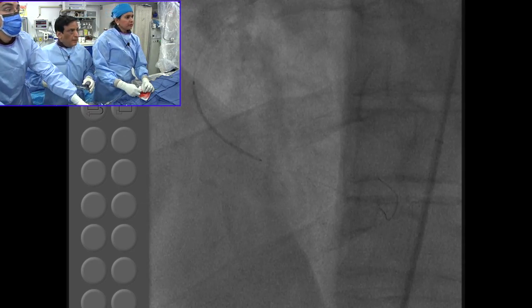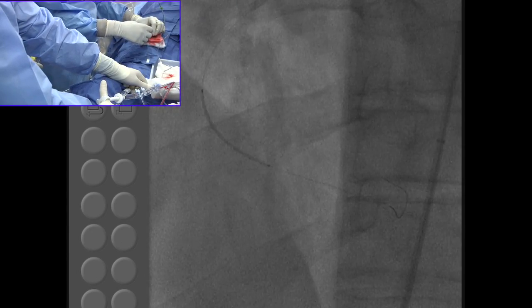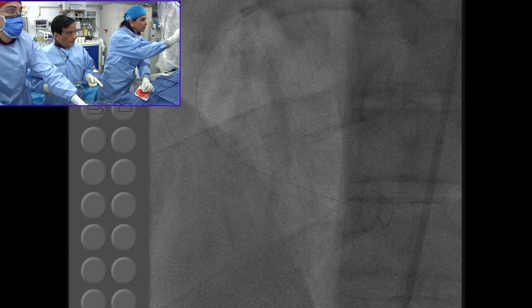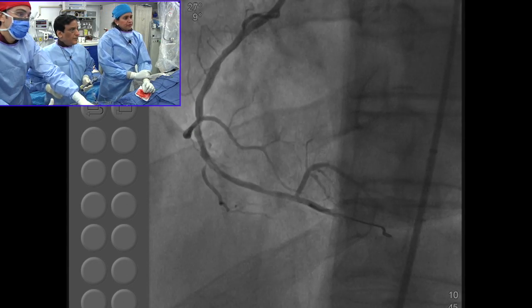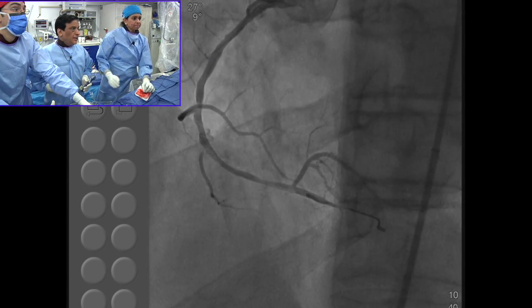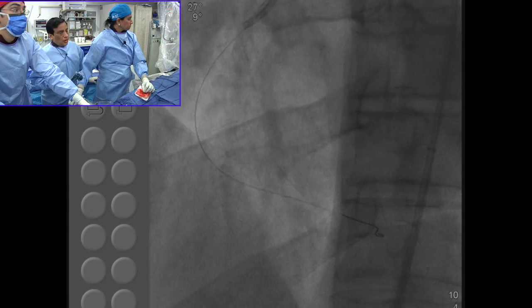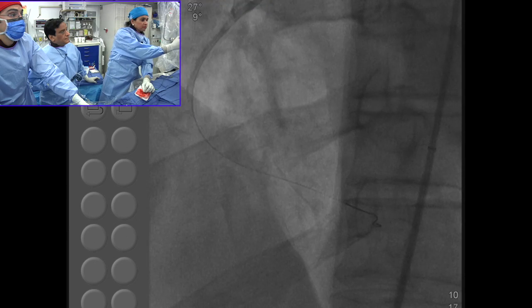I thought you'd take it down to the bifurcation. Full metal jacket here. No, but distal, take a better picture again. I think you had to go up to the bifurcation, right? There is a lesion there. You may need two stents, but one has to be just before the bifurcation. Don't have to overlap, but 3-4 millimeters. Even by collateral, it stops there. If you go back to the earlier pictures.